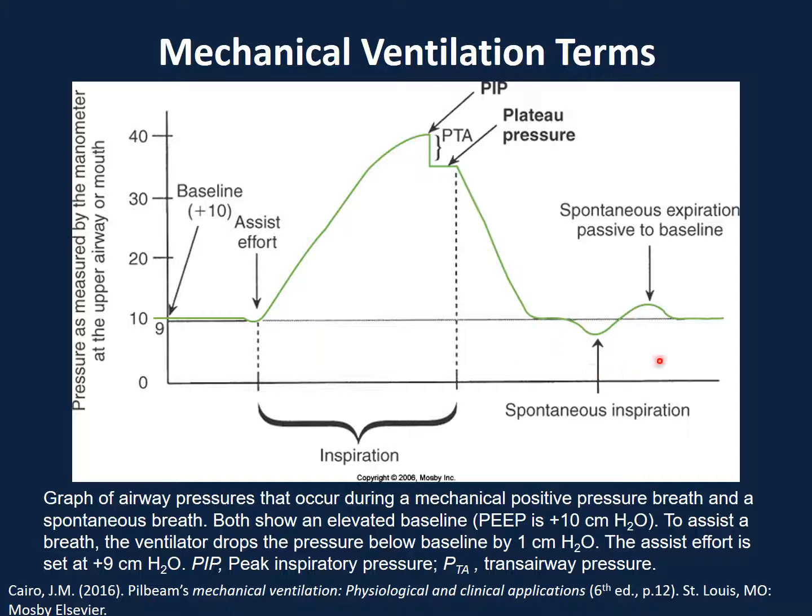Now, contrasting this with the part on the right, this is a spontaneous breath, where we allow the patient to breathe spontaneously while on this baseline of plus 10 centimeters water pressure. So when you take a deep breath in, you create negative pressure, so therefore there's a dip, right? Suck in, and then you breathe out, and then there's positive pressure pushing the air up, okay? But the average pressure here is still 10. So for this spontaneous inhalation and exhalation, this patient is said to be breathing on a CPAP of plus 10 centimeters water.